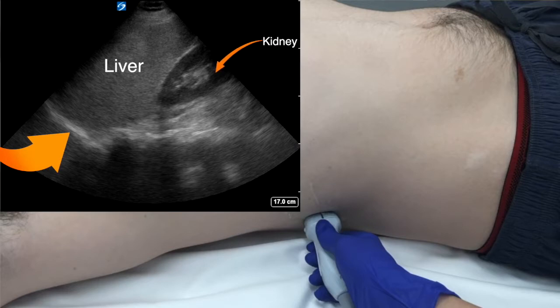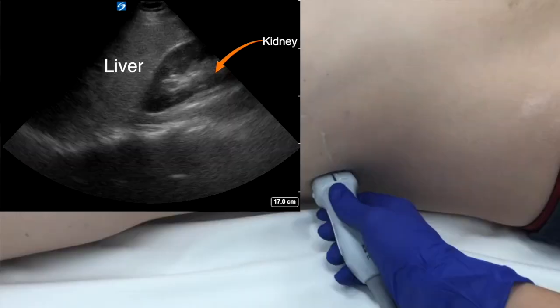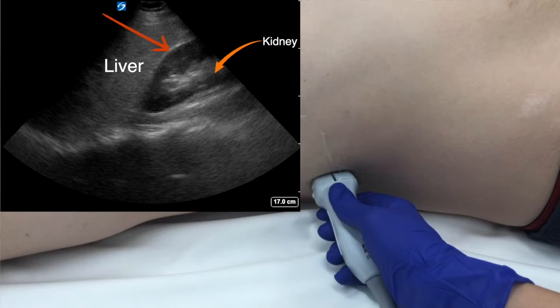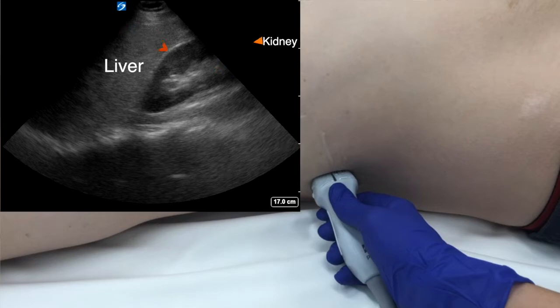The diaphragm appears as a bright stripe that should interface directly against the liver. Any dark space between the diaphragm and the liver is evidence of blood. Additionally, there should be a bright interface between the liver and the right kidney. Although in obese patients there may be fatty tissue in this area, appearing as a gray area between the liver and the kidney, any dark space in this area should be considered blood.